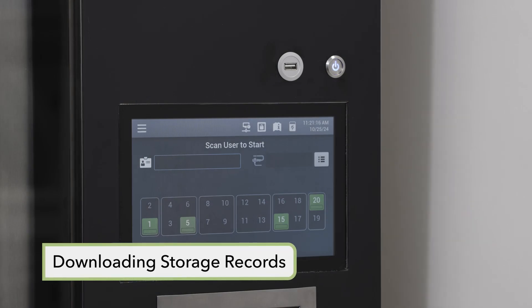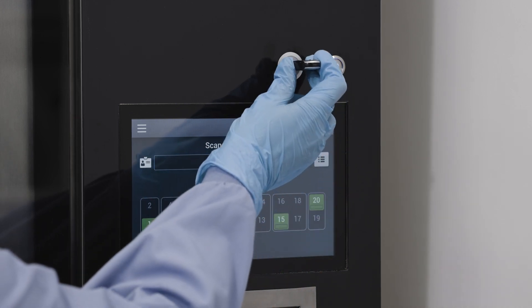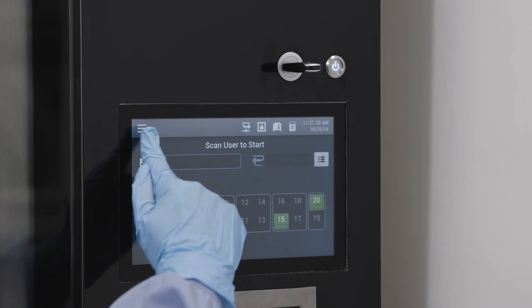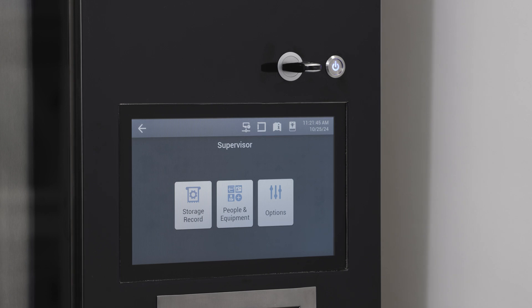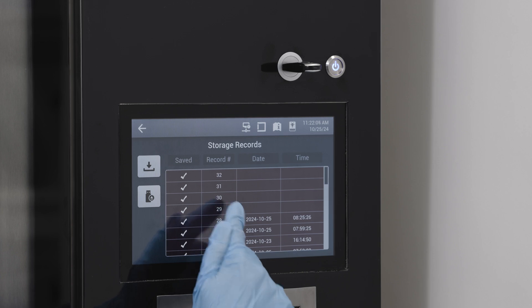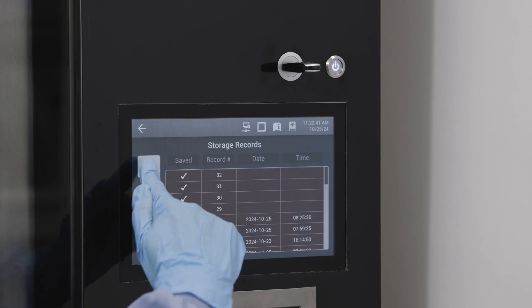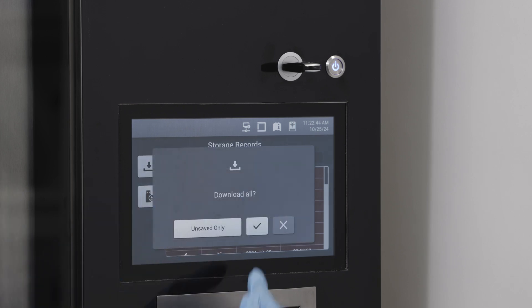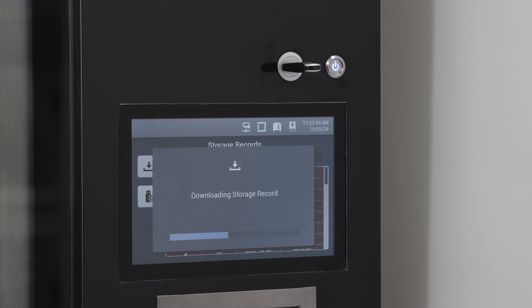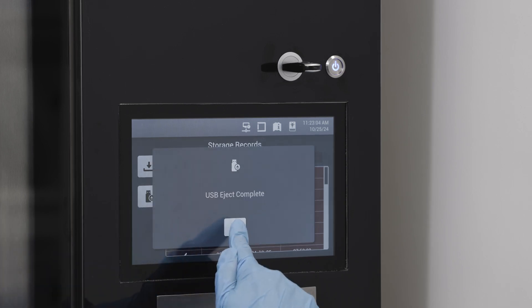Downloading storage records from the cabinet requires the use of a USB drive; single or all records can be saved. Insert the USB drive into the USB port on the control unit and enter the supervisor mode. From supervisor mode, select storage records. On the storage records screen, search for a single record and when identified, tap download to save the information to the USB. When downloading all records, tap the download button and tap OK. Or select unsaved records to only download those not previously downloaded. Once complete, tap 'eject USB' on the screen to safely remove the flash drive.